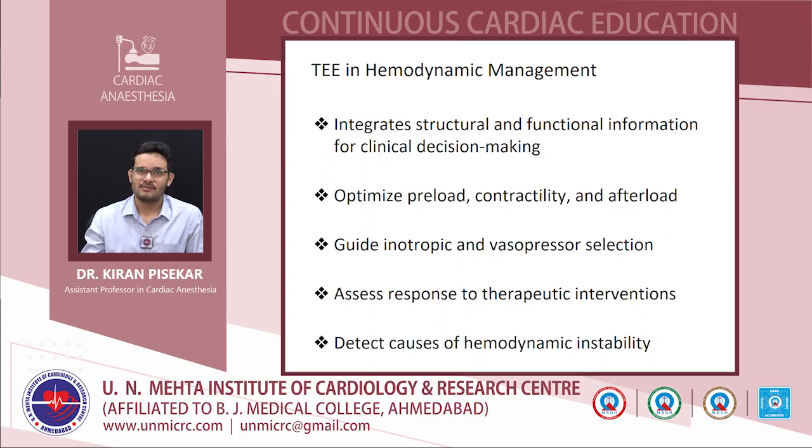So it helps in hemodynamic management. We can optimize the preload, contractility and afterload using TEE, and it helps in guiding the inotrope and vasopressor selection. We know the EF, we know the volume. By comparing IVC diameter, ventricular volume, ventricular contractility, ejection fraction and the hemodynamics of the patient, it helps us in selecting the inotrope or vasopressor needed for the patient.